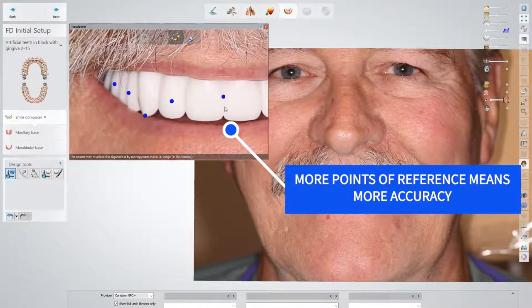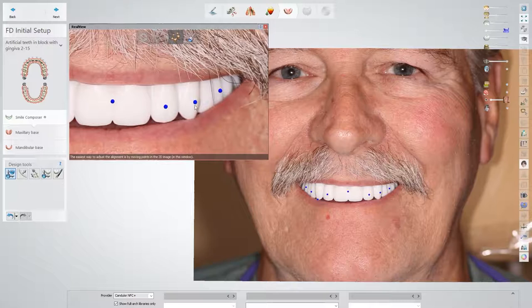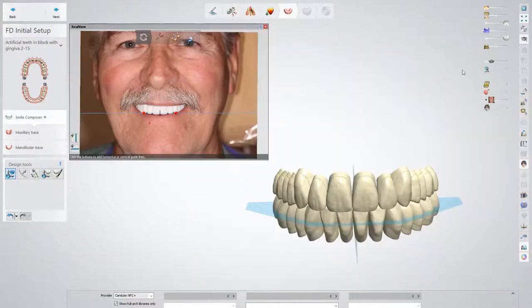Place points on all these anatomical landmarks — embrasures, cusp tips, zenith of gingiva, and the middle of the teeth.